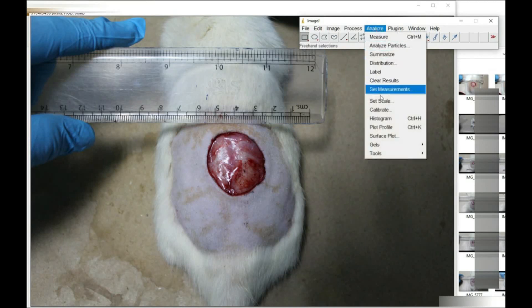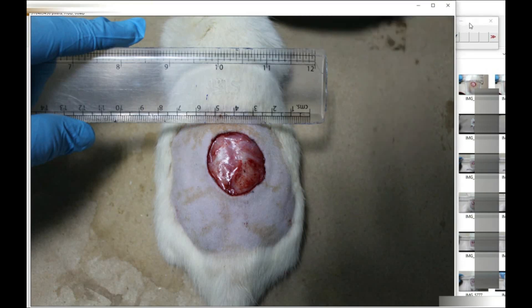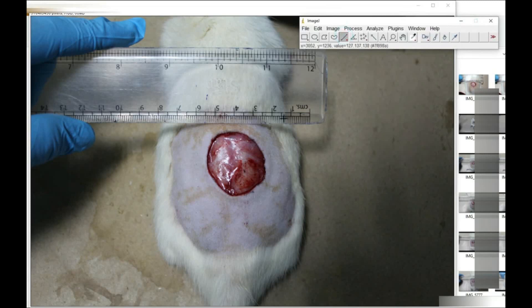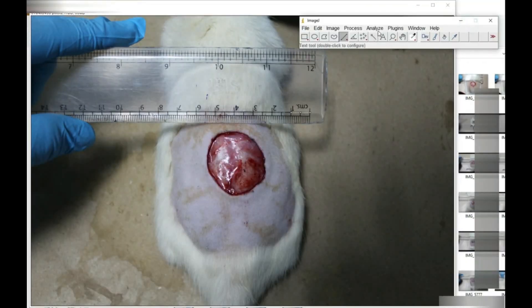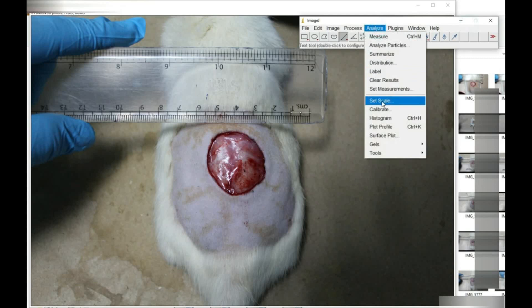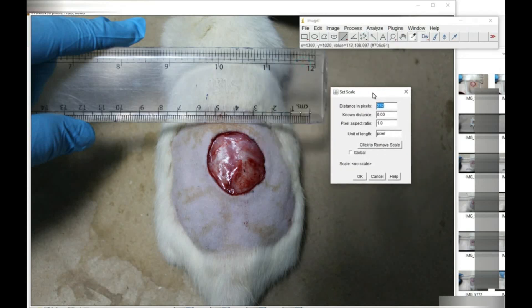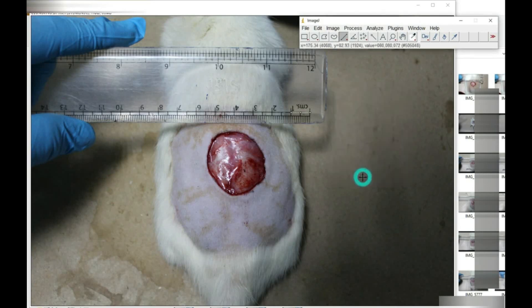To measure the wound area, we will go to the Analysis tab and select 'Set Scale'. For scaling, we will use the line tool and measure the scale. Here we have taken one centimeter, which is 10 mm, so we will set the scale by entering 10 in the software. The known unit will be mm, and we will set it as global so that all measurements going forward will be in mm.